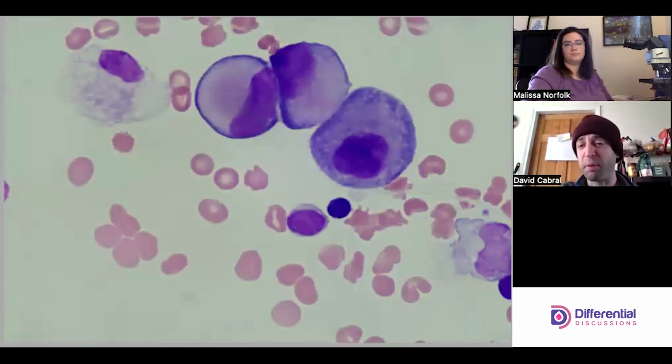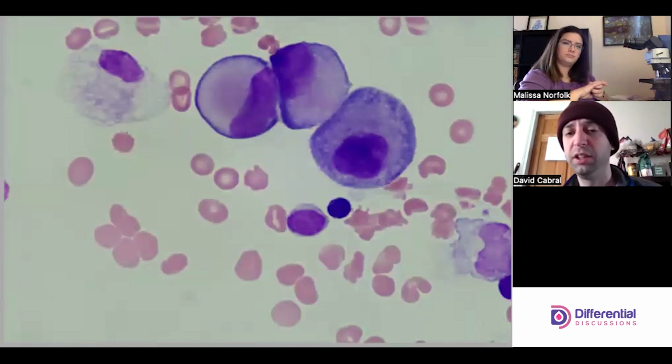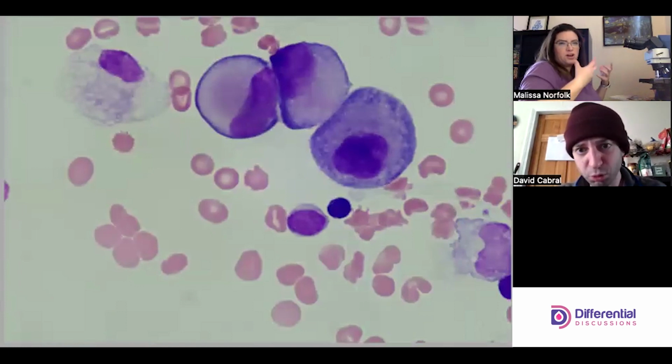So I sympathize doing body fluids. You might see a cell or two across 100, 200 cells, and you might agonize, but we're seeing these cells repeat. They're not necessarily dominant, probably 10% or less, but they're there over and over again. Oogly. Dark.